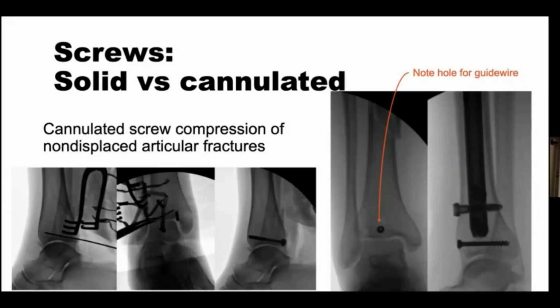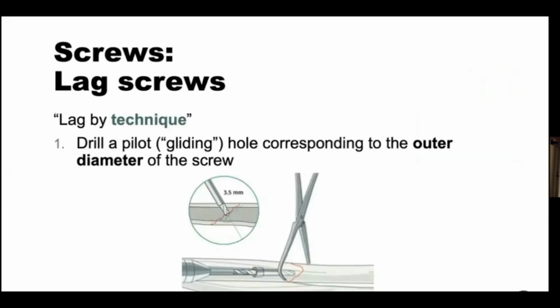and that reminds you that this is in fact a cannulated screw. And obviously now that I look at these, they are not from the same patient because the first screw is placed from P to A, the second one's placed from A to P, so forgive me. But these are cannulated screws.